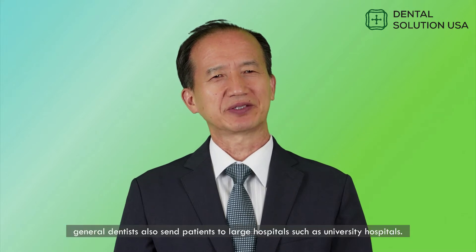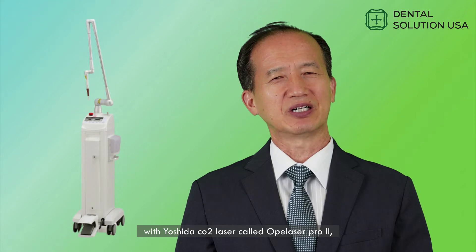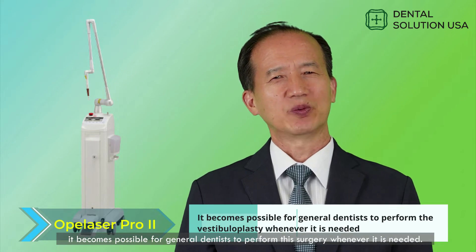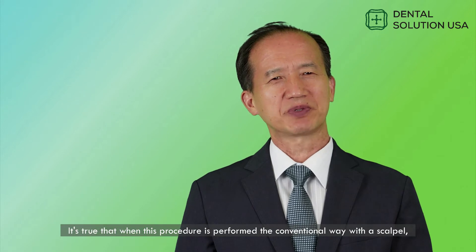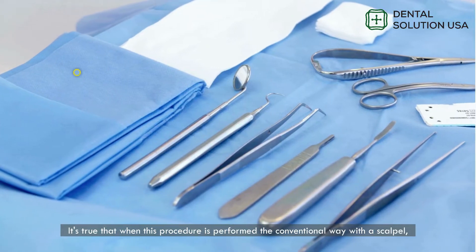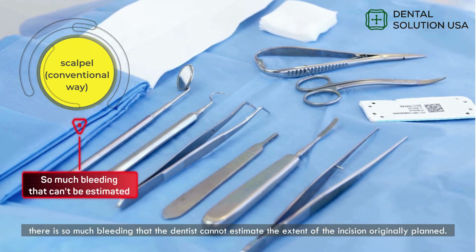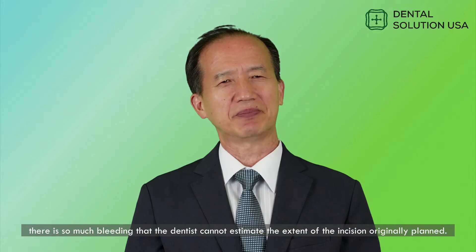In Japan, general dentists also send patients to large hospitals such as university hospitals. However, with the Yoshida CO2 laser called Opelaser Pro II, it becomes possible for general dentists to perform this surgery whenever it is needed. It's true that when this procedure is performed the conventional way with a scalpel, there is so much bleeding that the dentist cannot estimate the extent of the incision originally planned.